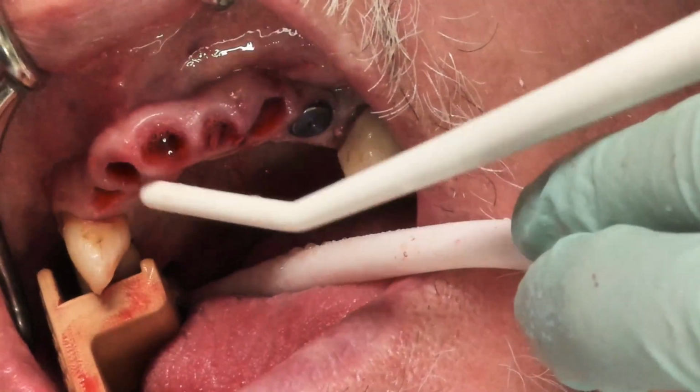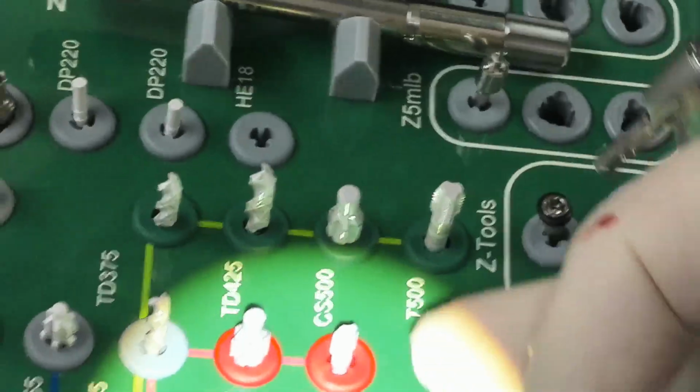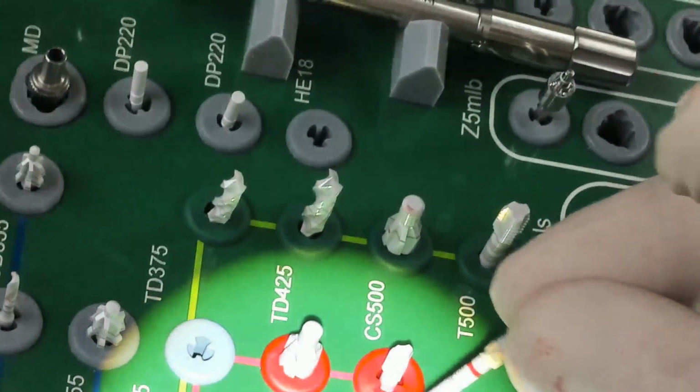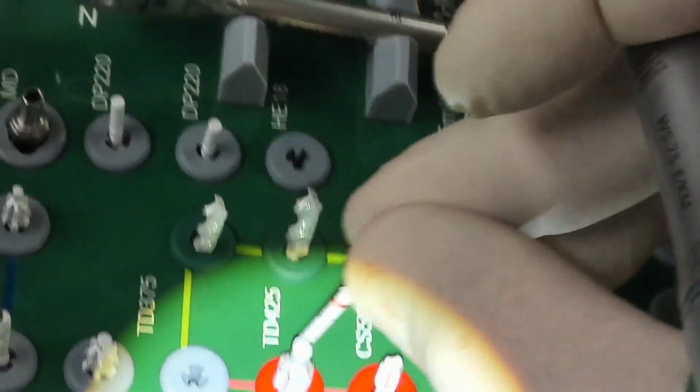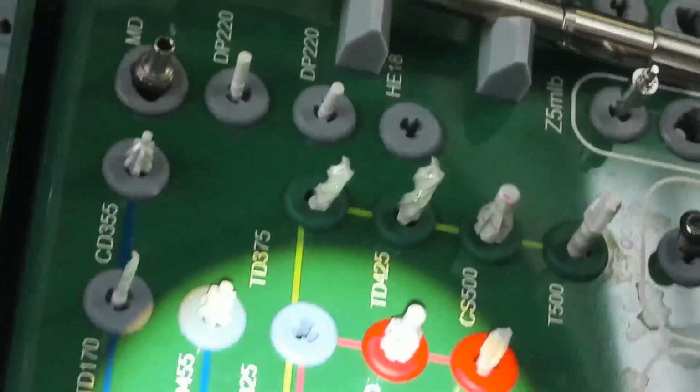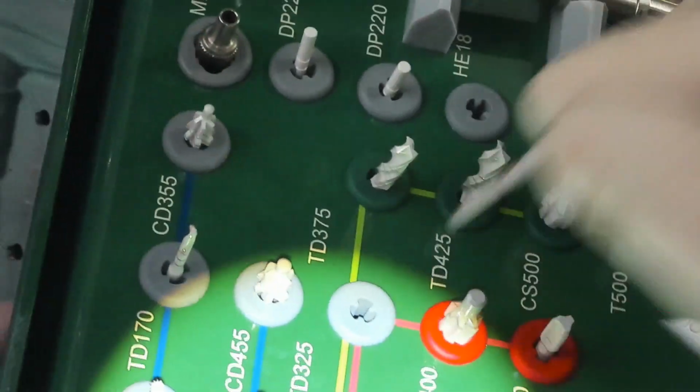All right. Let me see this kit a little closer. So here's our Z-Systems surgical kit, which you'll see in the hands-on later. What I'm doing is I'm just following now. The red is going to be for 4.0. So I'm going to the third drill here, the 3.25. But with Alan's bone, I might even go a little more to the 3.75. This countersink drill is really for widening up the emergence profile of the implant, which I'll show you, but we're probably not going to do this in an extraction site. Maybe a little bit in the number 7 site. So now I'm going right now to the 3.5 drill.